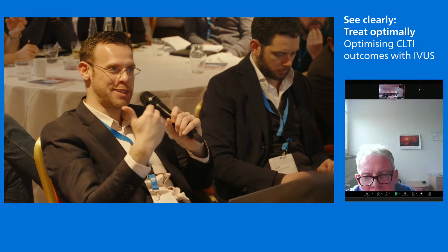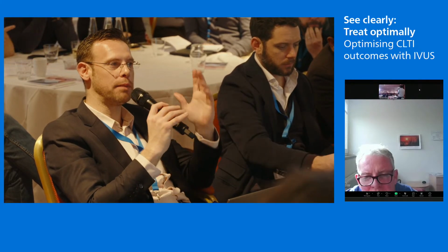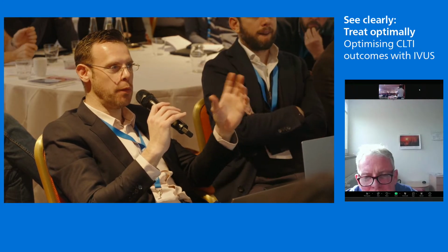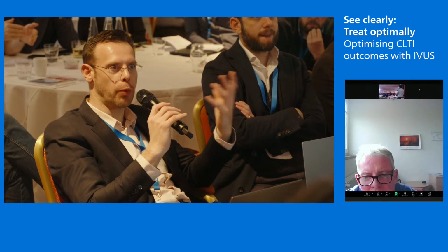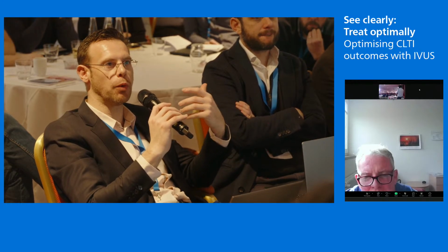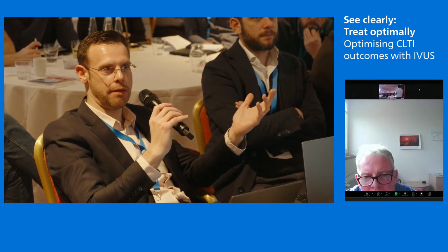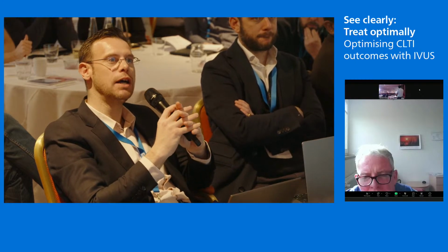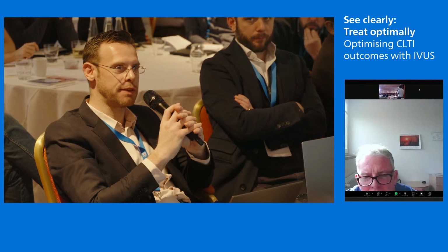It was when I pushed it too far and on that one particular case, I snapped 2 helixes. So it will stress, and when you stress it, you're going to weaken it. It's not going to work as well, and then ultimately you may well find that you snap it, which I've done. But generally speaking, it will track up and over, and I've done so quite successfully with the 8 French.